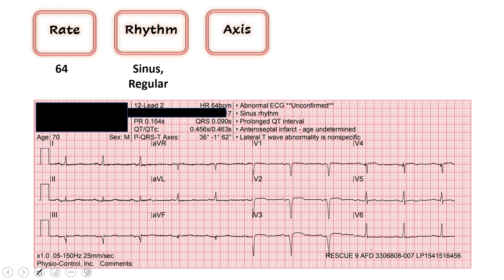Next we look at our axis. We always look at leads I and AVF. Lead I is our left thumb — the majority of the QRS vector is up, so our left thumb is up. AVF is mostly down — the majority of the QRS vector is down in AVF, so our right thumb is down. That leaves us with left axis deviation.